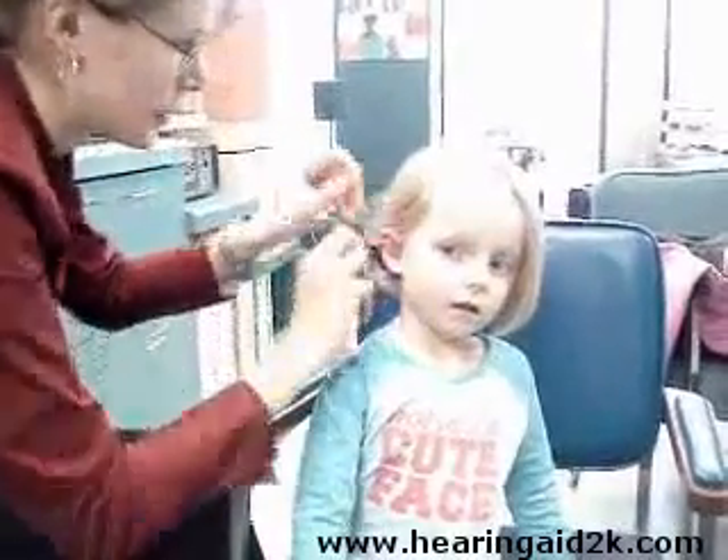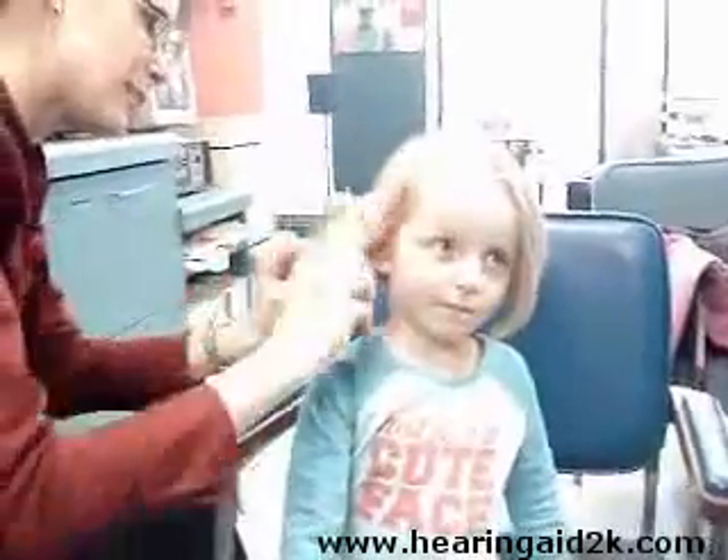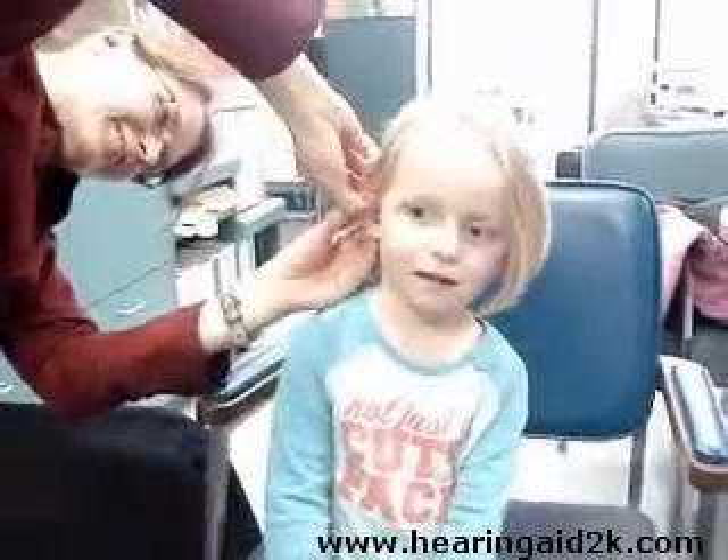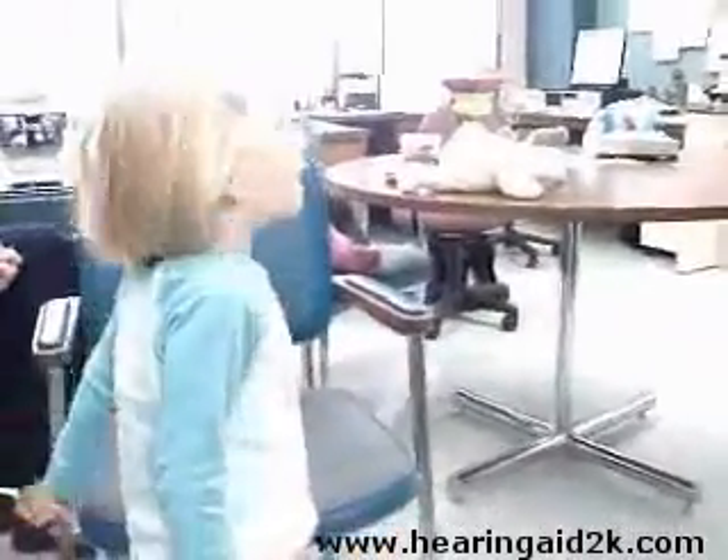An ear mold — it goes in kind of like a corkscrew. It goes behind your ear, and then you put your hair over top. Are you ready for me to turn this one on? Okay, here we go. Hello! Can you hear lots better now? Yeah! You can watch TV and it can be louder, and when we go outside, you'll get all kinds of new sounds. You are hearing everything louder, aren't you?